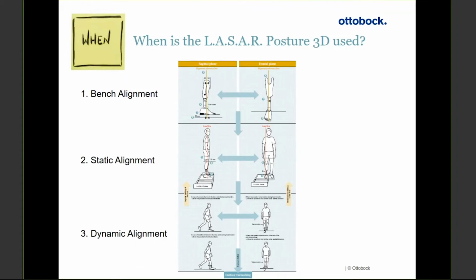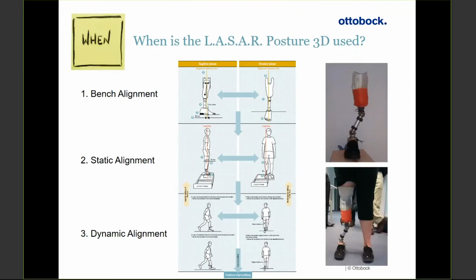But one thing that I always find very interesting is the conversation around which way the pylon should lean. And this is actually quite a funny little picture here that my colleagues back in Australia did. You think that we do everything upside down? Well, we do.